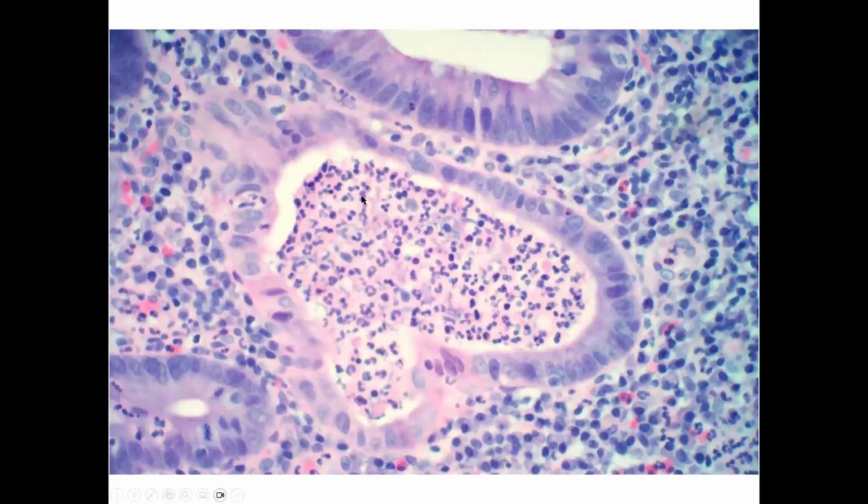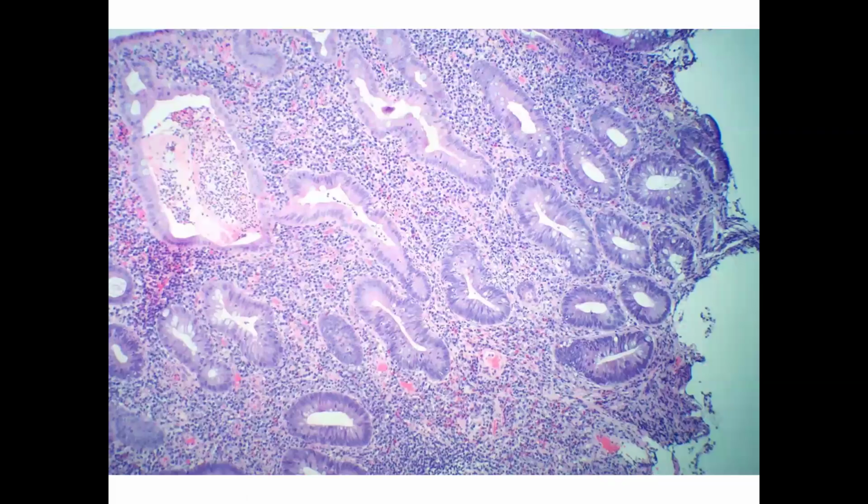When the neutrophils fill up the gland and create this pocket of neutrophils, this is a crypt abscess, another type of active colitis. Here's an example on low power where the space between the glands is very expanded. There's some really funny gland shapes here. There's decreased gland density, and the spacing is a little bit irregular compared to before.